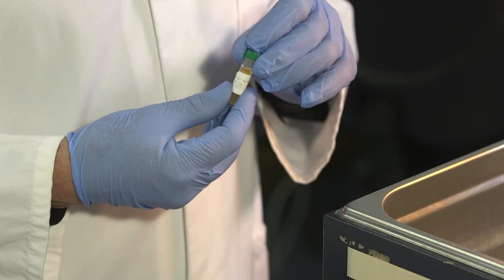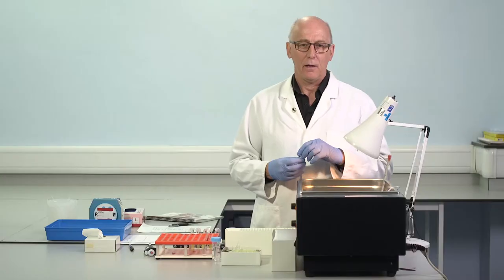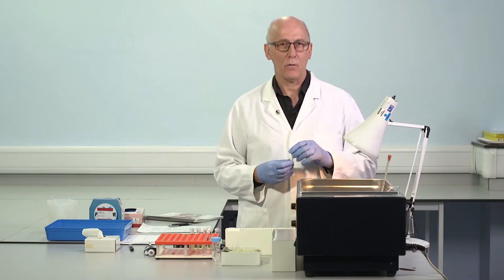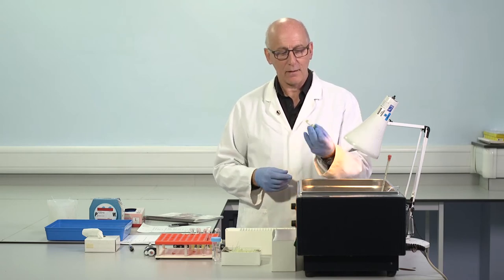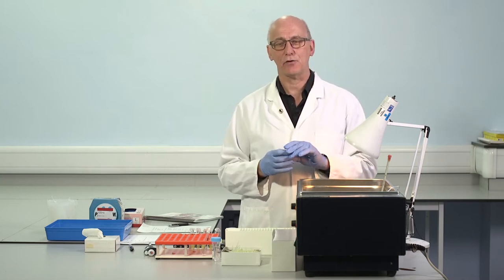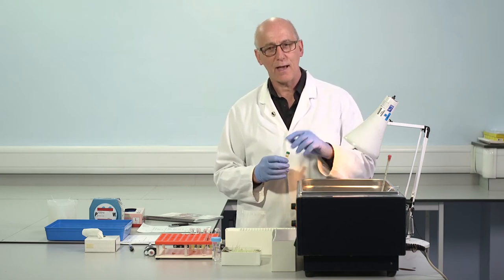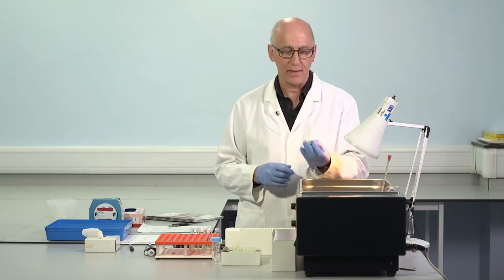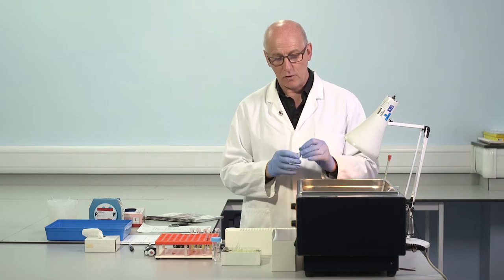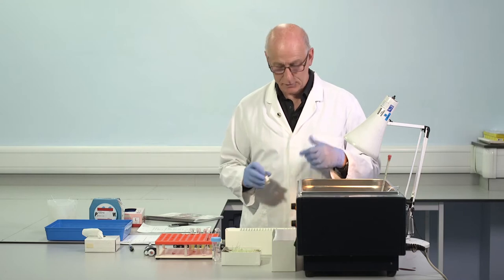So we'll be using a normal control. And this is prepared in this way. It's been thawed in the water bath. And when we thaw in the water bath, this should be for somewhere between 3 to 5 minutes. When we've completed that thawing, mix by inversion, just in case there has been any precipitation of, for instance, von Willebrand factor during the processing and storage. Shouldn't happen, but this allows for that possibility and resuspends any precipitate that may have occurred. So we have a normal control. The reagents are now up to temperature, so we're able to proceed.